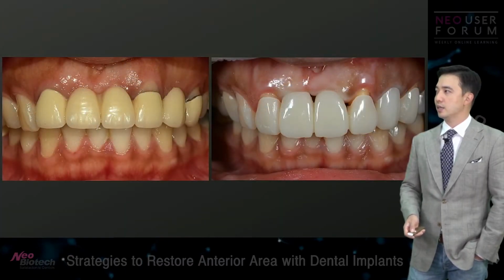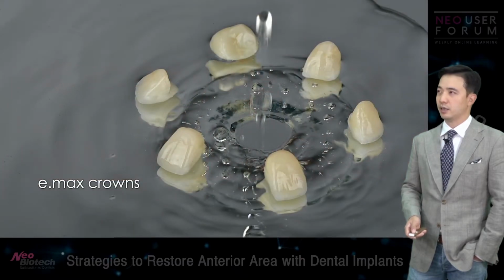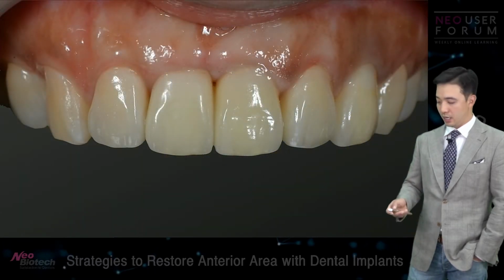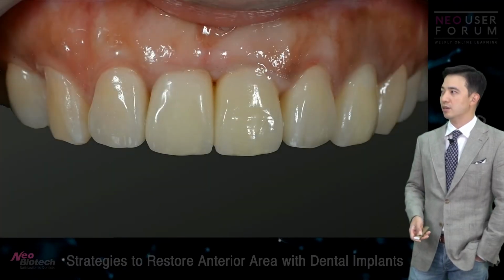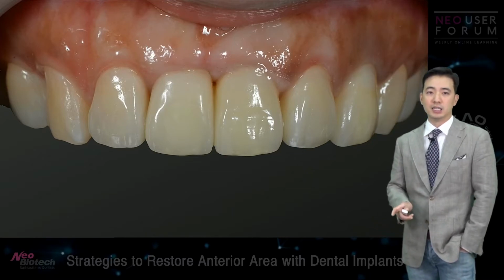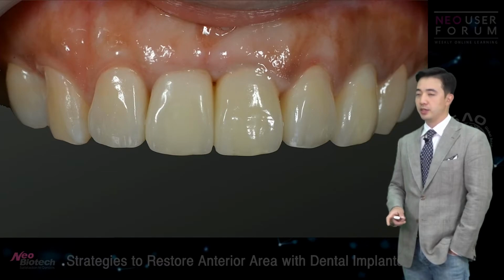And finally, after waiting a couple weeks, I think we waited for 2 weeks, we went ahead and placed the Emax crowns on it, and this is how I got the papilla for the final result. So, I mean, it's not perfect, far from being perfect, but at least it got better than the provisional restoration.